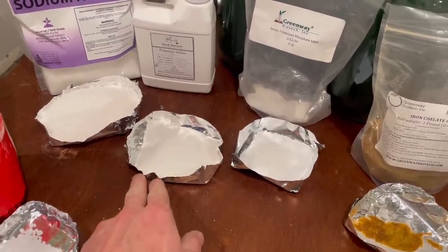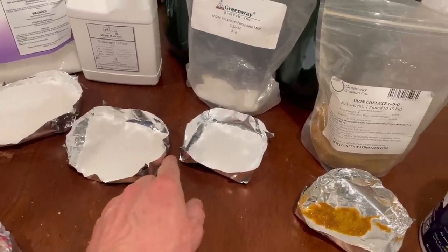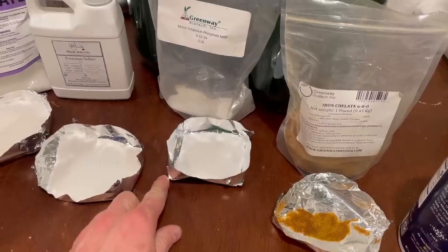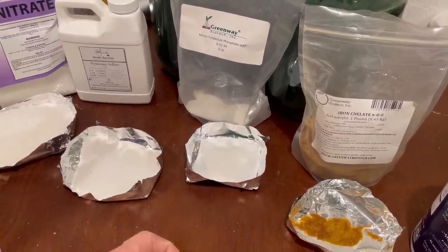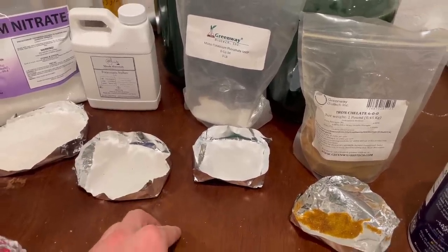That will decrease the amount of sulfate, so to compensate I've increased the portion of potassium sulfate — using 112 grams instead of 100 grams. I also ran out of ammonium phosphate so I'm using potassium phosphate, which means the amount of potassium in my solutions will be higher than last time, but a little extra potassium isn't going to hurt the algae.